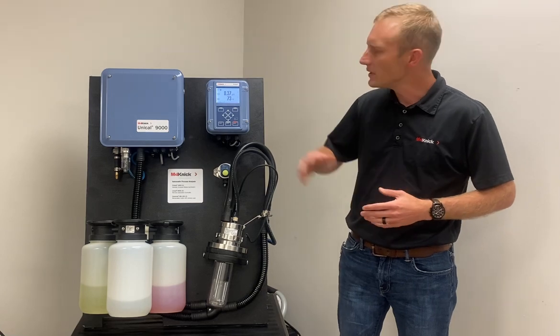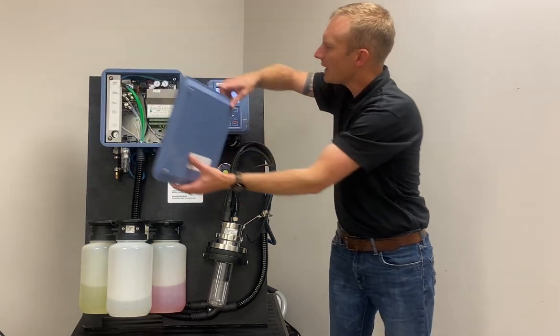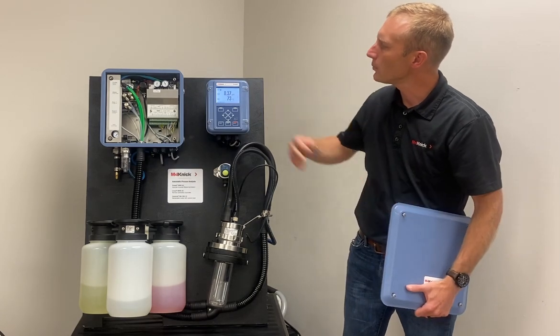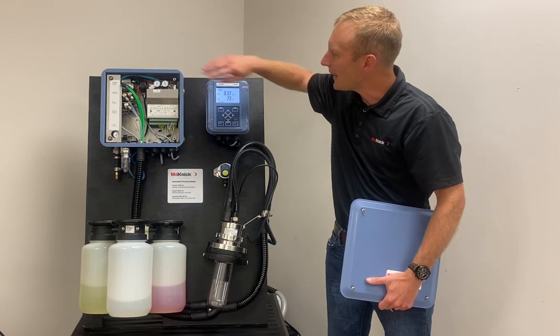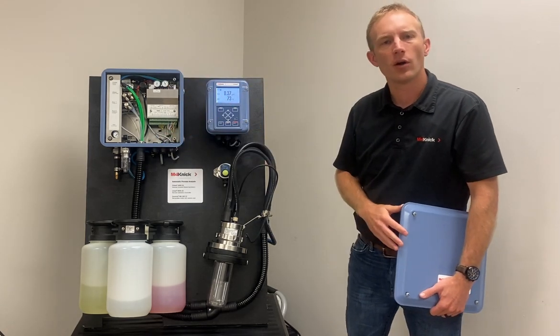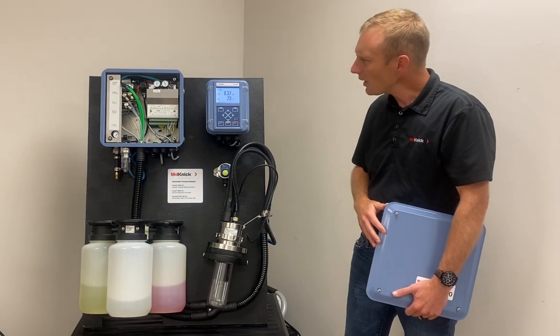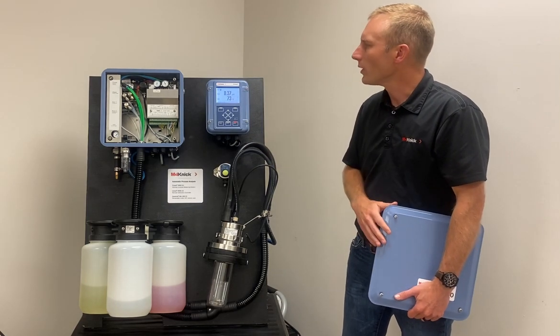The first of which is the Uniqal 9000 control box. Inside this control box, if we open it up, we see a number of solenoid valves, the main electronics component, and this is where we're going to bring our utilities into — both air and water for cleaning.